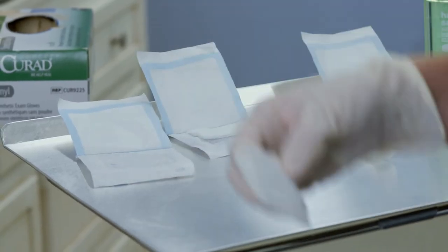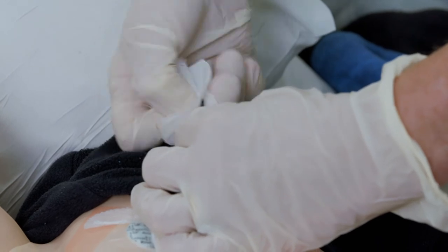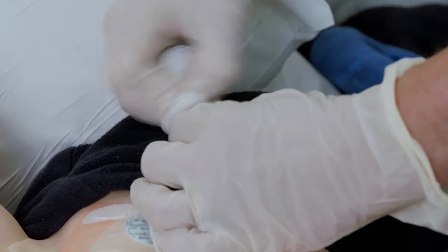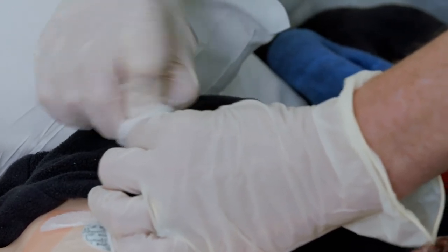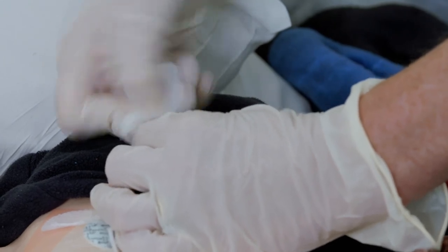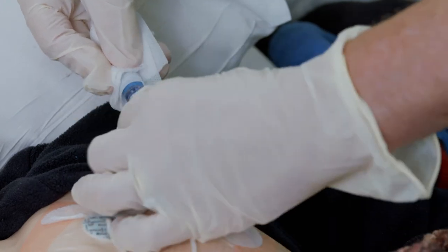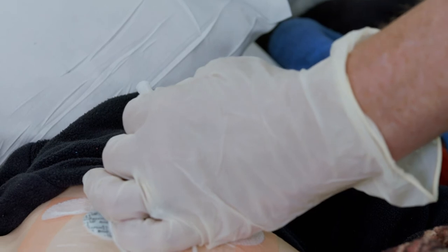Pick up the gauze and alcohol pad together. Before removing the Needless Connector, scrub with the alcohol pad and gauze where the end of the line meets the Needless Connector. Use a windshield wiper motion. Do this for 15 seconds. With the same gauze and alcohol pad, remove the old Needless Connector and throw it away. When you're done, throw the alcohol pad and gauze away.